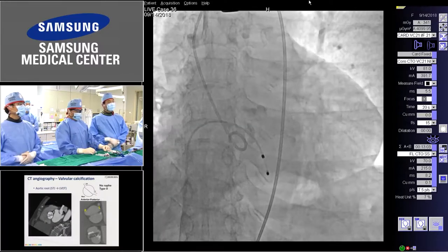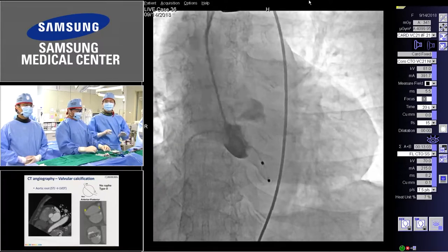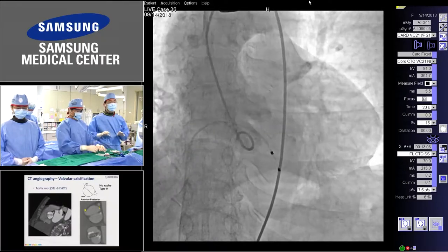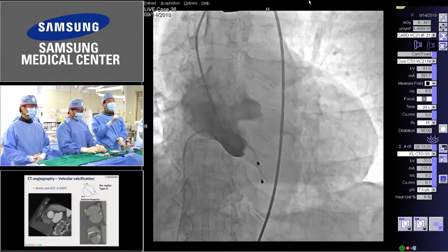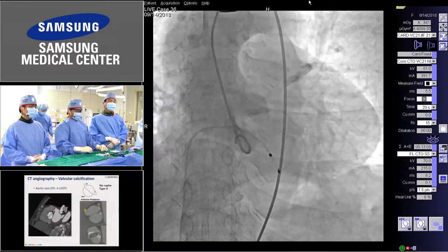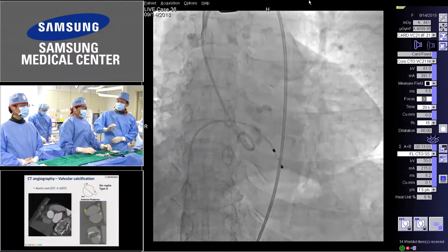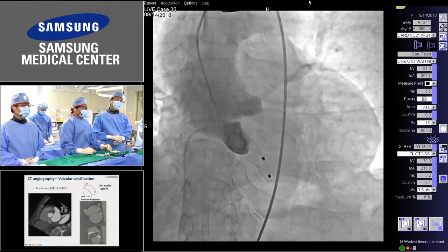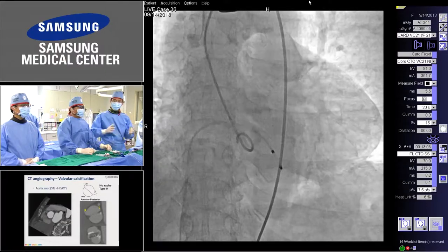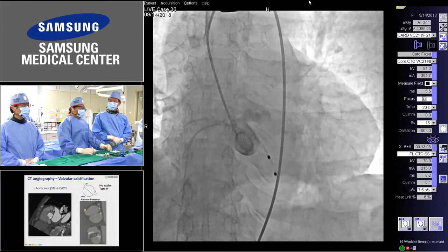So I'd like to ask, why is the measurement strategy so different between the two valves? Of course, one is self-expanding and one is balloon expandable. It's a difference. And I think if calcification is not so severe like this patient, even in a bicuspid valve, we don't need to care about undersizing or superior implantation. I'm not sure. I'd like to ask the experts, especially Dr. Grube and all the specialists, to tell me how to decide the size.